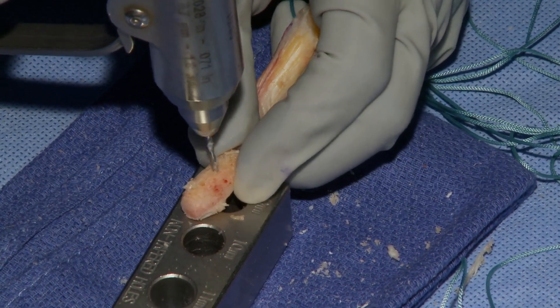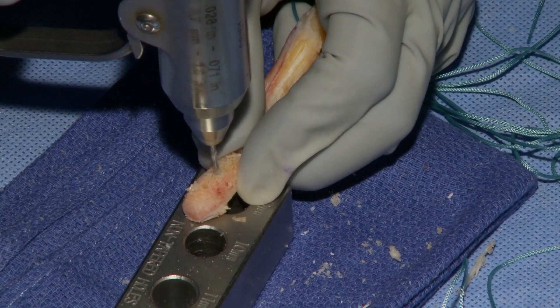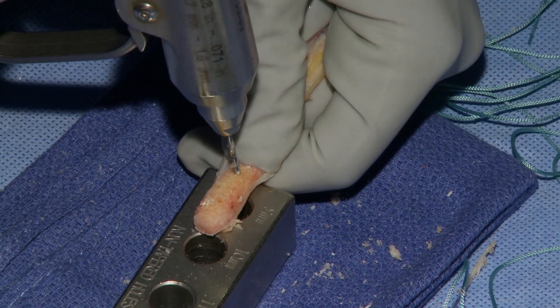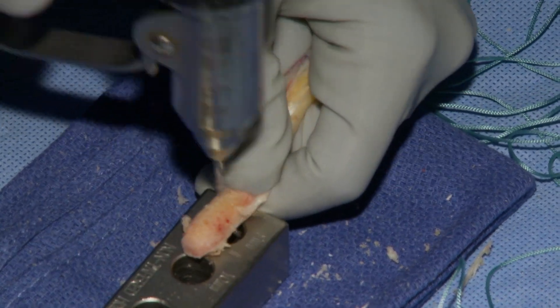Use your best judgment — if the bone plug is kind of thin or the bone is excellent quality, you may just want to put two drill holes in so that you don't compromise the bone plug and it doesn't snap. If you're uncertain at any point, just report it to the surgeon.